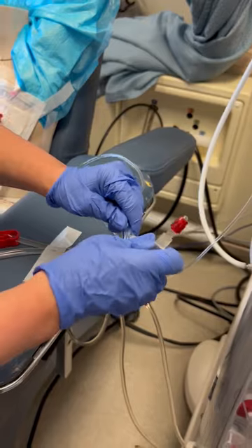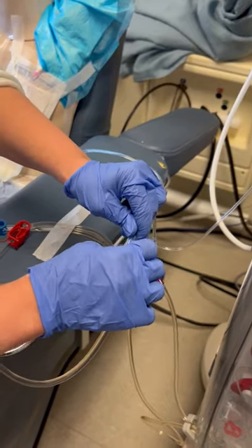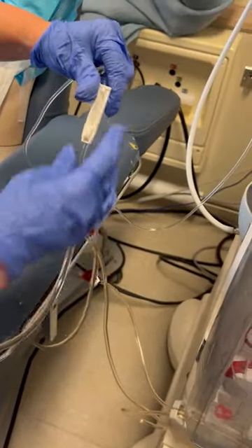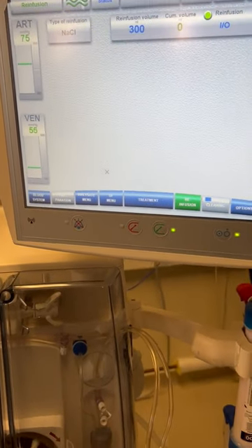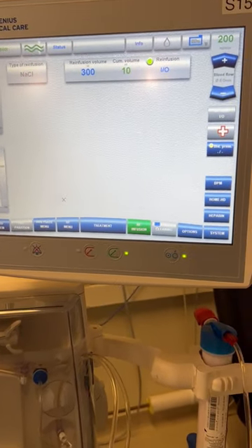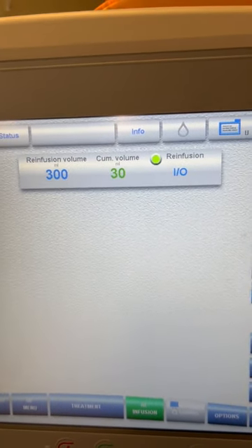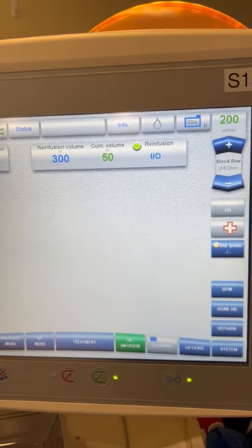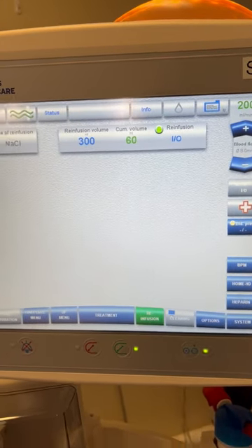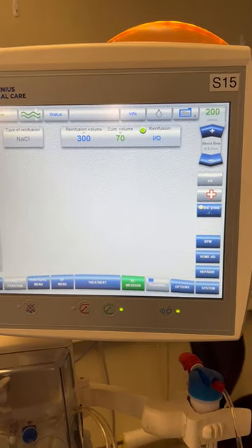Take the cap off, making sure we don't touch any connections. We're going to open the saline roller clamp as well as the arterial bloodline clamp, and hit OK under start re-infusion. At this point you can see it's rinsing back your blood using saline. You're looking for your bloodline to turn watermelon in color. Once the bloodline is watermelon, go ahead and stop the machine.